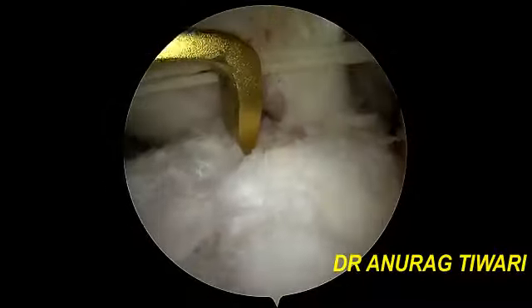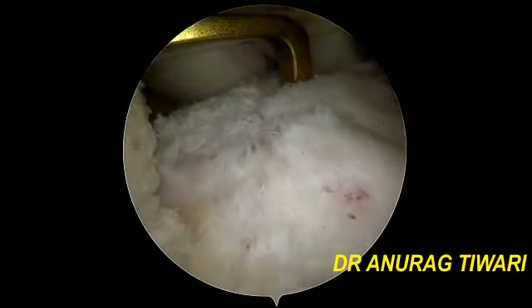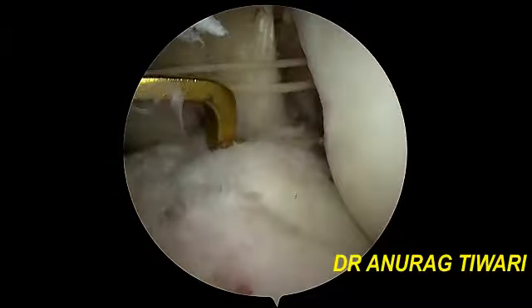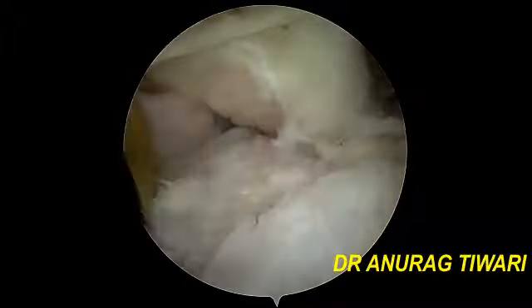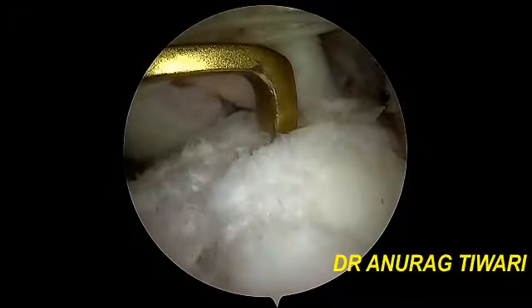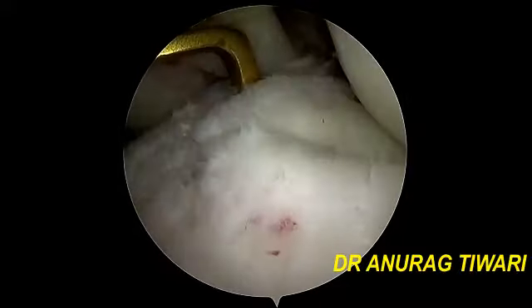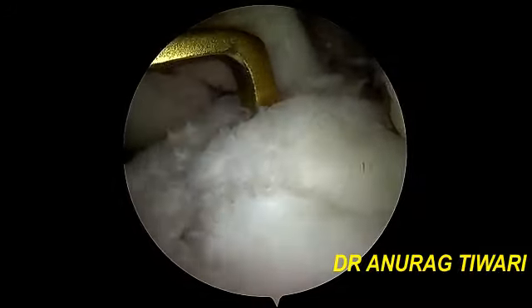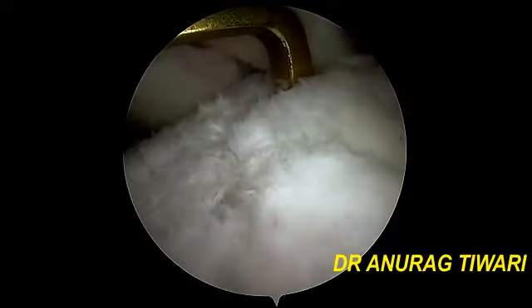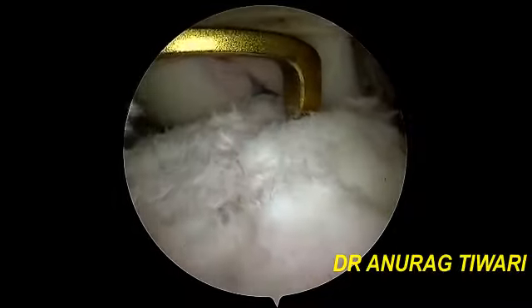Now you can extend the knee up to 90 degrees, meaning flexion can be reduced, and this is the tibial jig. So this is an elbow jig or elbow aimer. You should be very careful while using this type of jig. The guide wire will exit through the elbow portion. It's not from the tip, it's through the elbow. This is the anterior horn of the lateral meniscus, or the anterior attachment of the lateral meniscus, which you are seeing. The guide wire should exit just posterior to the lateral meniscus.